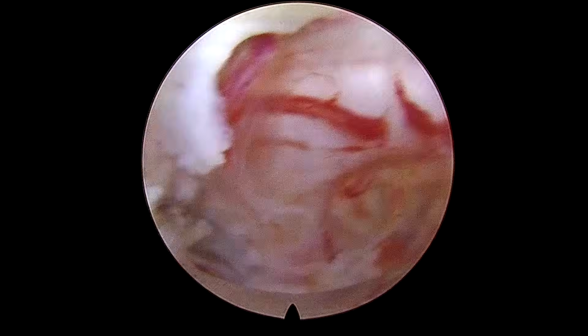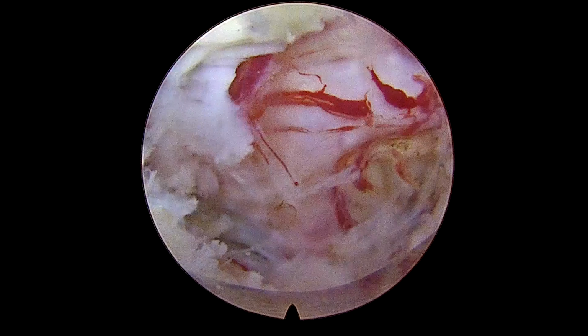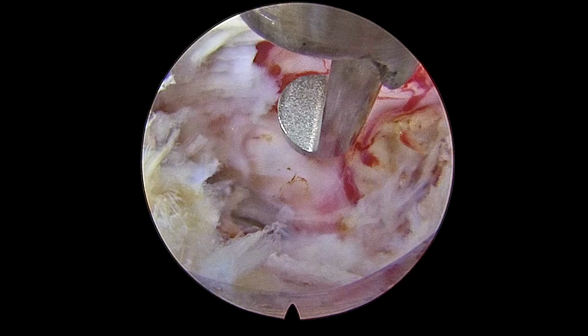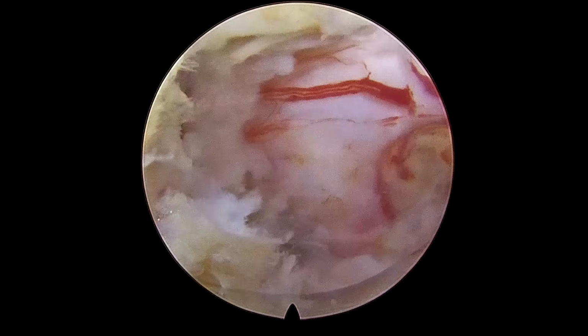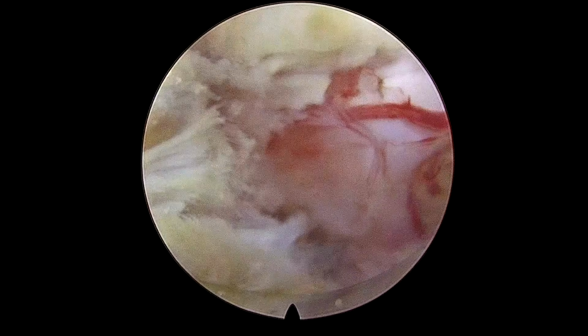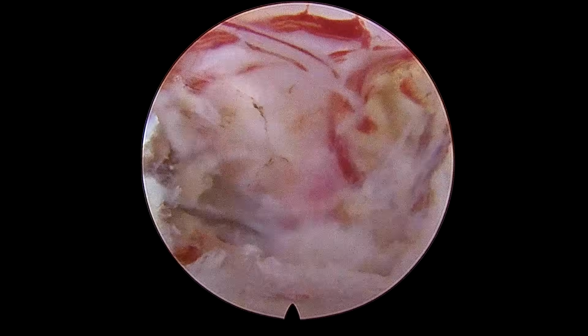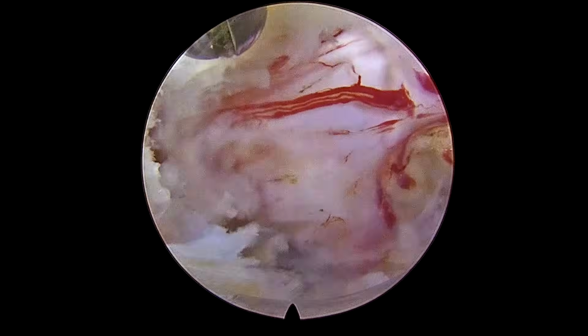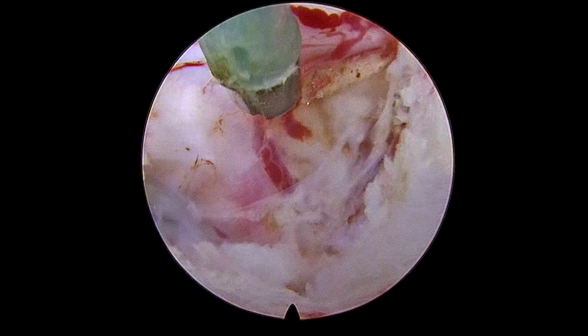So here now the root is completely exposed. We removed a little bit more flavum just for the vision. Actually it is not necessary to remove the entire flavum. Our target in this case was exposure of the root only.